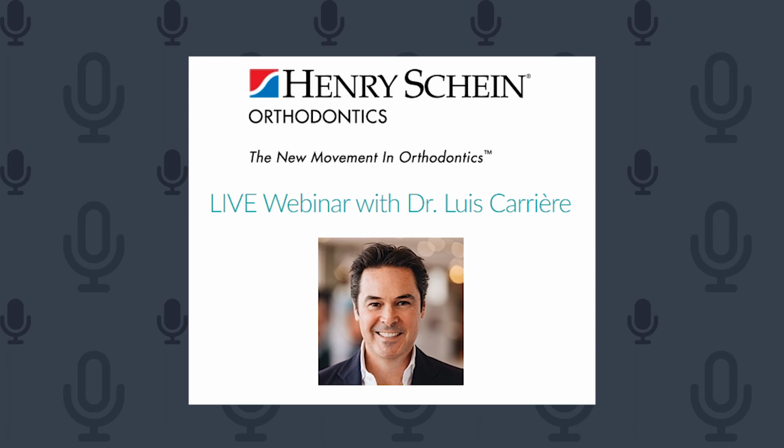One of them, we with elastics trying to close the bite, and the other one will be the patient trying to open them. So back and forth is very, very inconvenient for the root of those incisors. We don't want to establish root resorptions or generate problems at this level. So we need to avoid any kind of back and forth. So the idea is to reposition the tongue and release the case with the wires to be the ones closing.